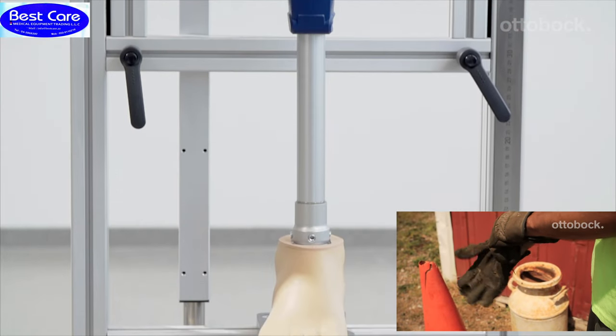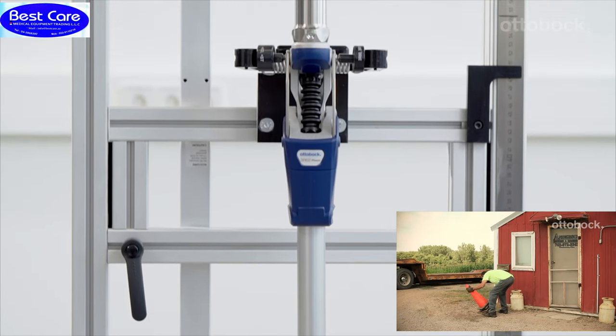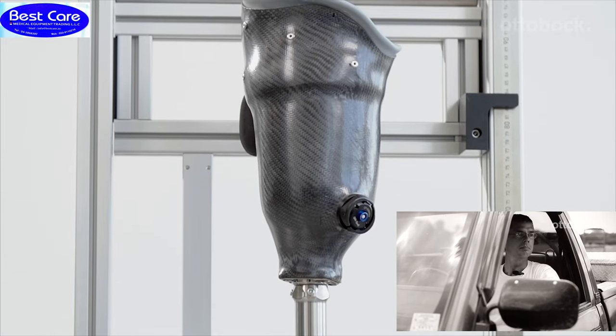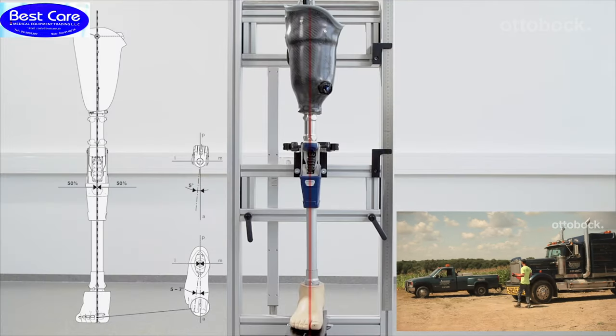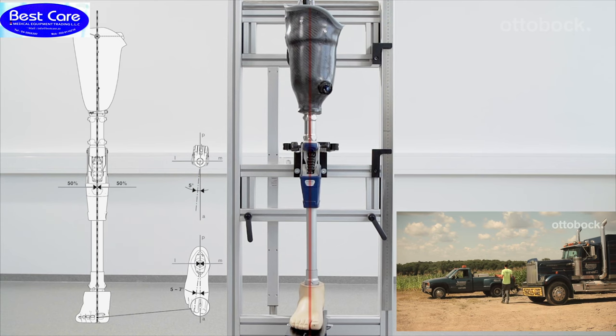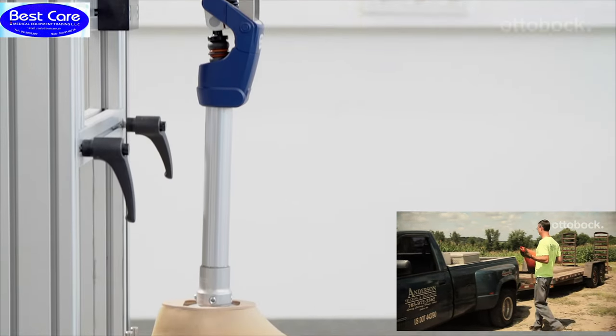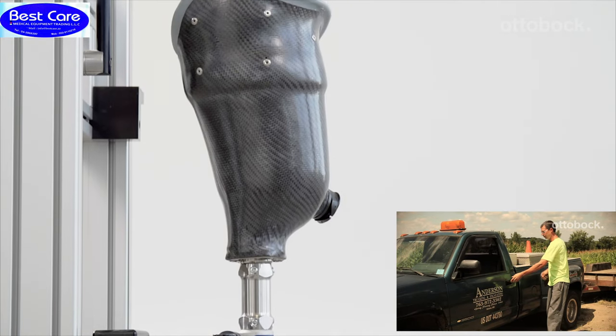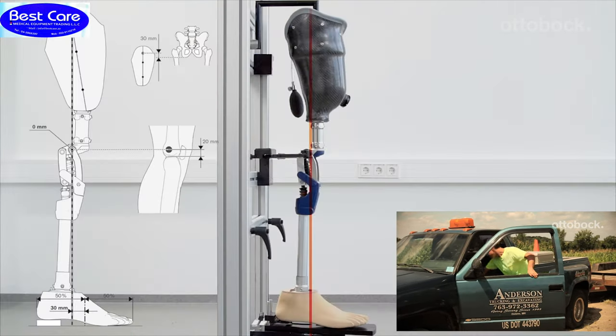The alignment and adjustments are easily completed in the following steps: bench alignment, static alignment, and dynamic fitting. For the correct bench alignment values, please refer to the displayed table.